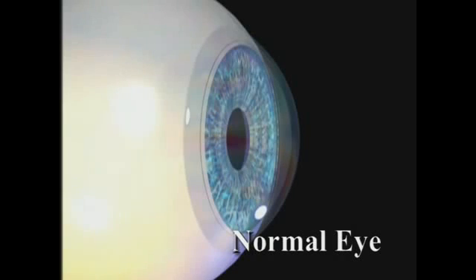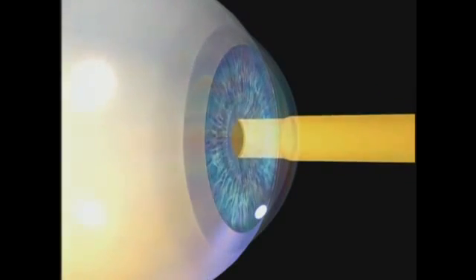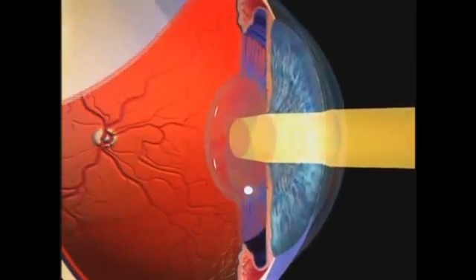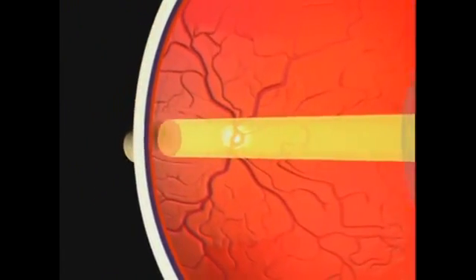To better understand how the laser corrects refractive errors, it helps to understand how the eye works. In order for an image to focus clearly on the retina, the cornea must be of the proper curvature. After entering the cornea, light rays then pass through the pupil and through the natural lens of the eye to come to a point of focus directly on the retina.